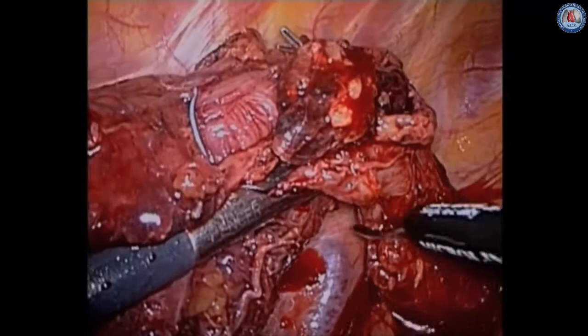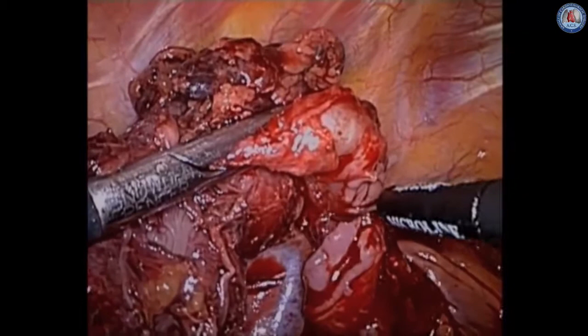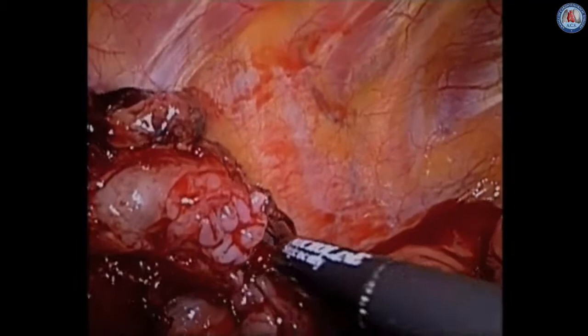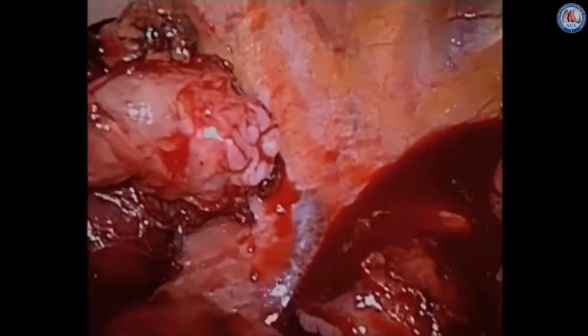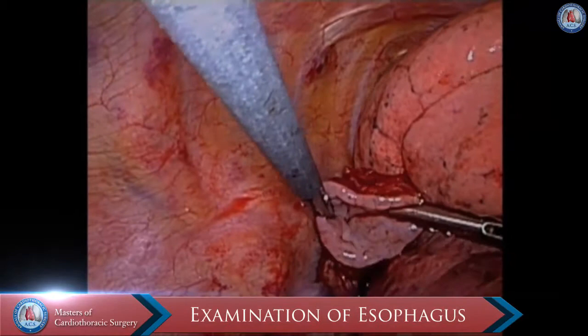You can certainly extend this high into the thoracic cavity if needed, depending on the location of your tumor. Once completely divided, the posterior inferior incision is extended by a couple centimeters, a wound protector placed, and the specimen delivered. You can get some bleeding and can use cautery if preferred. Once the specimen has been delivered, the end of the esophagus is examined. Occasionally we will dilate this with a Foley balloon catheter.